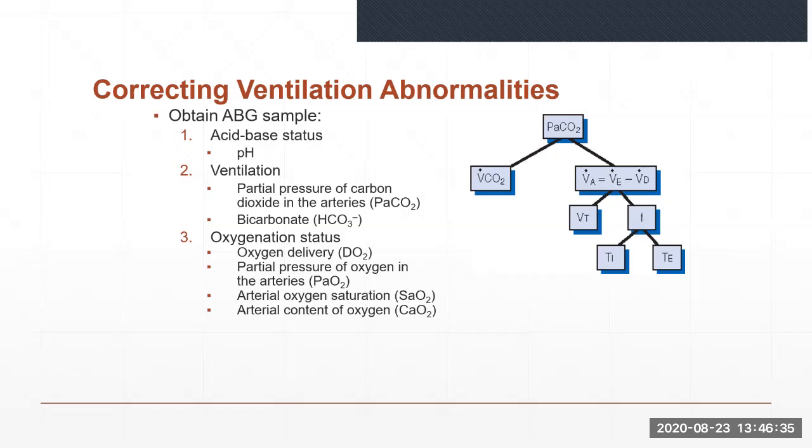Clinicians generally use the first 30 to 60 minutes following initiation of mechanical ventilation to gather information that can be used to evaluate the effectiveness of ventilatory support. These data include vital signs, breath sounds, and assessment of respiratory mechanics. Ventilator graphics can also be a valuable resource when evaluating the patient-ventilator interaction.